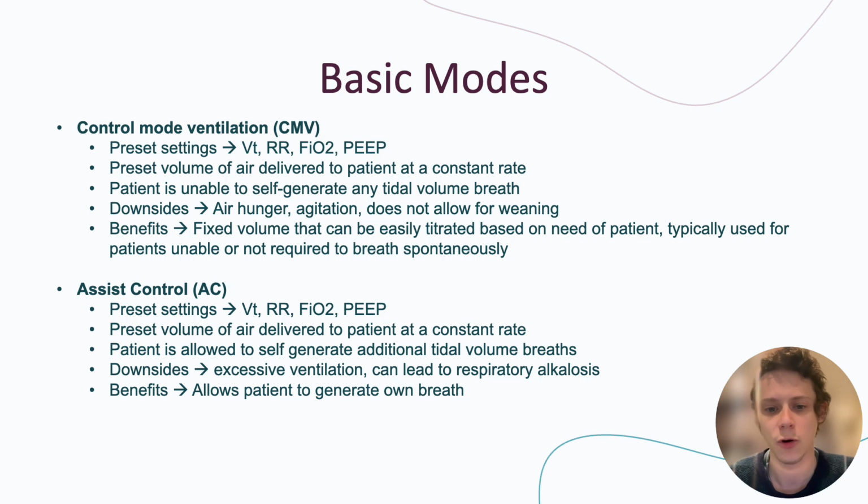So next we're going to go over some of the basic modes of mechanical ventilation. I'll go over 3 basic modes. There are a lot of different modes that are associated with mechanical ventilation. Some are very complex, but I'll go over the most commonly used modes. So first is going to be control mode ventilation, or CMV.